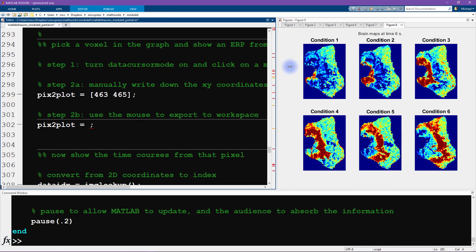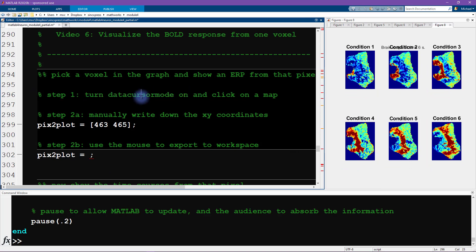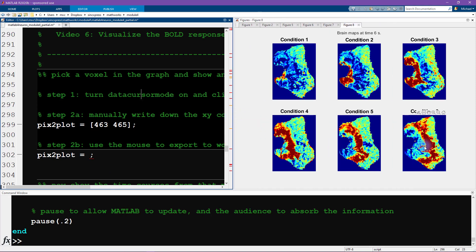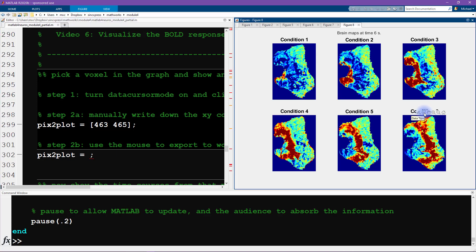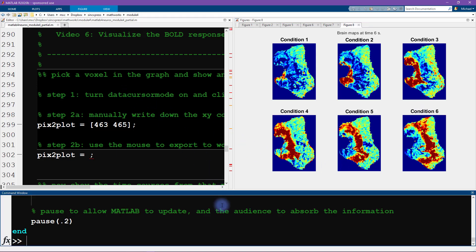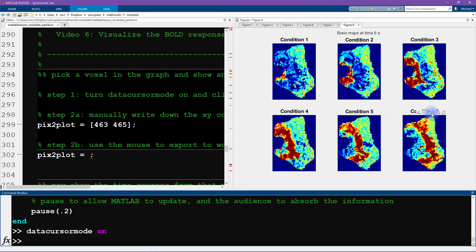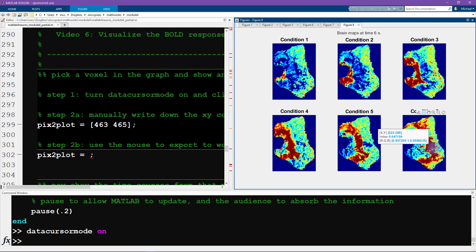Now we want to activate the data cursor mode — this is step one. There are two ways to do it: one is clicking on the figure itself. When you hover the mouse over an axis, interactive tools appear at the top — zoom in/out, pan tool, and the one we want looks like a little chat box for data tips. The other way is to type 'datacursormode on' in the command window. Now we can left-click on the image and a small window appears showing the image x,y coordinates and the color intensity value.